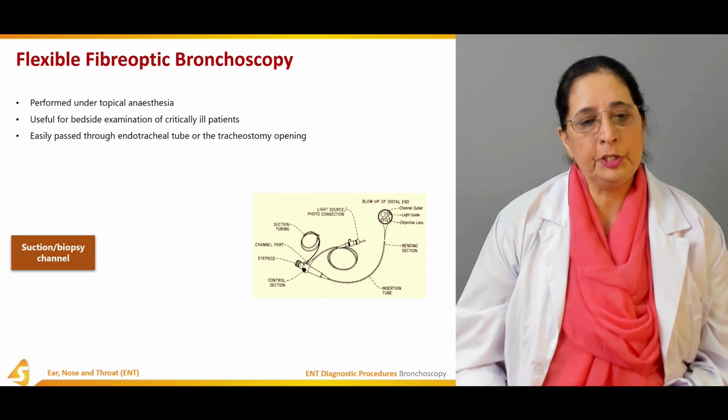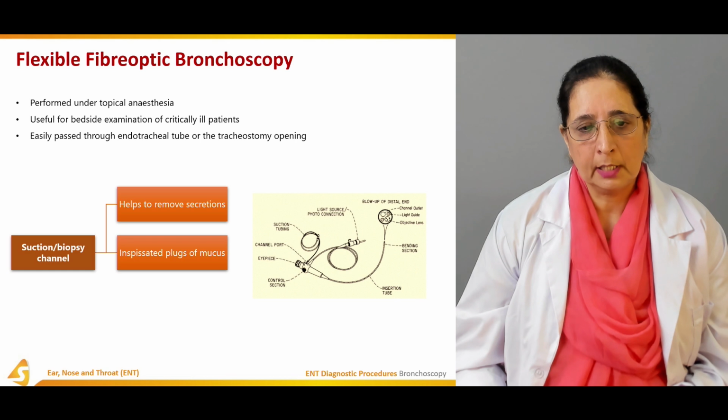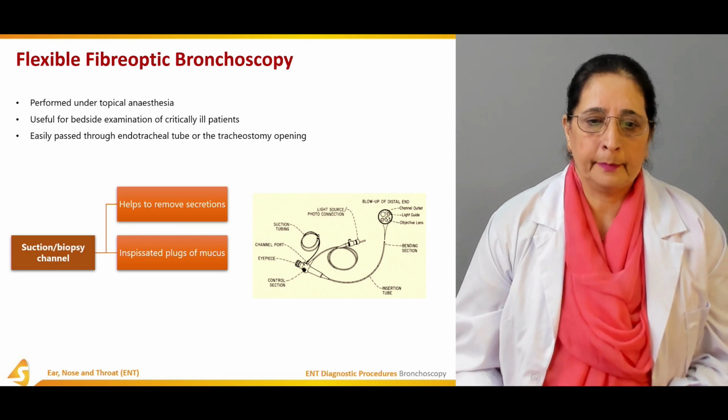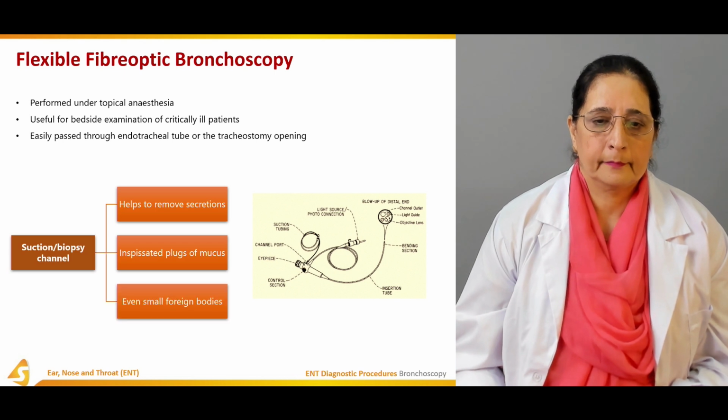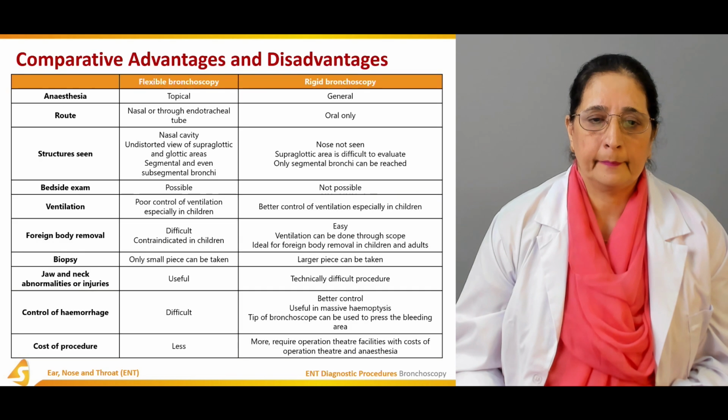Suction biopsy channel helps to remove the secretions, inspissated plugs of mucus. Even small foreign bodies can be removed.